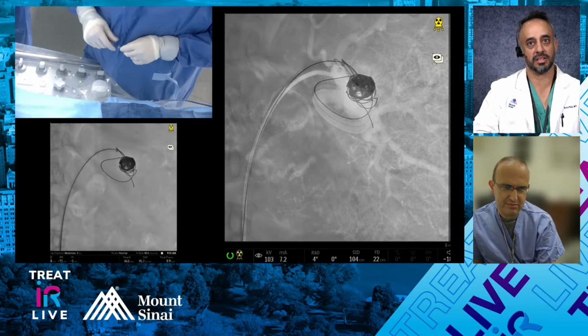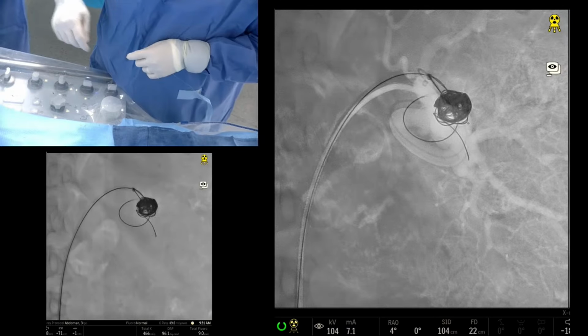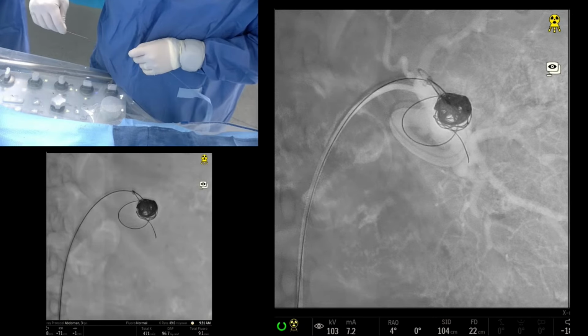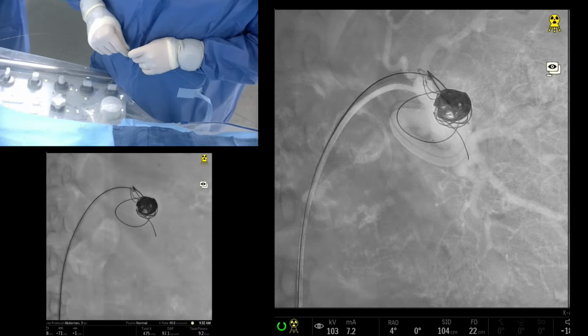I'm just going to try and reposition the micro. You think it's a big deal that it's flipping in here? I think it's worked. You've been doing this just like that.